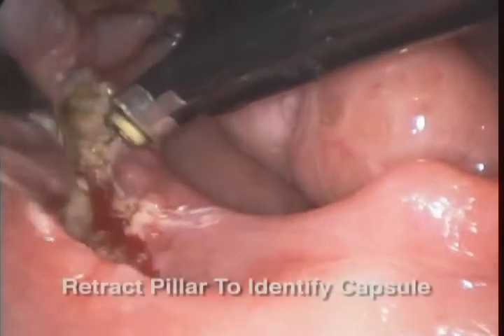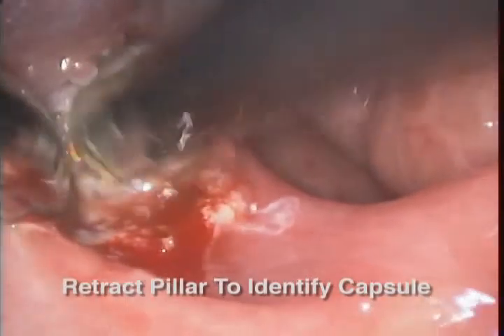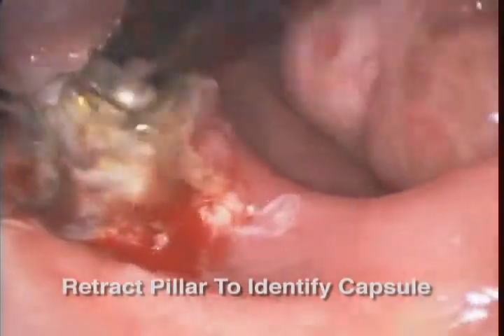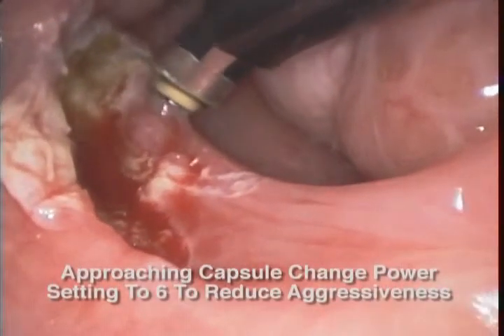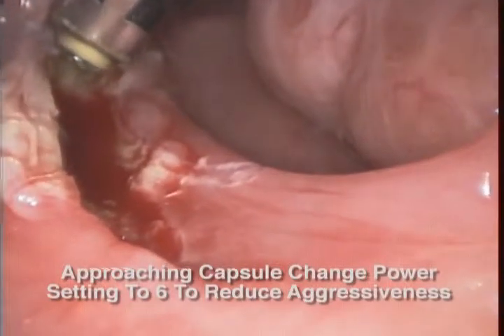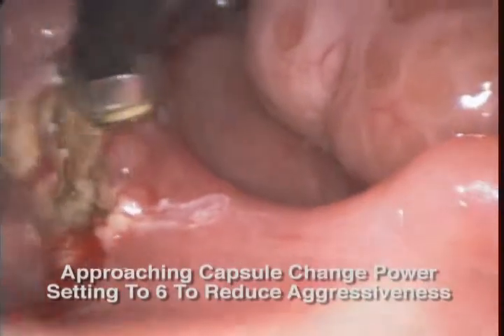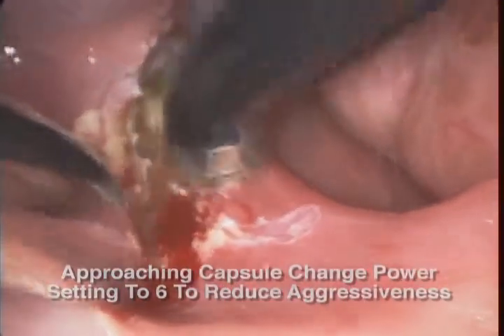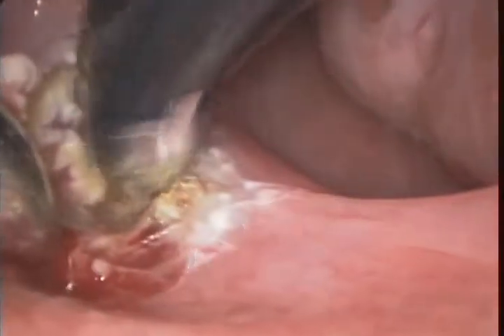I'm using the Heard retractor here to retract the pillar to try to identify as we're getting closer to the tonsil capsule. And as we're getting closer to the capsule, we will turn the ablate setting down from 9 to 6. Now, when you turn it down from 9 to 6, a few things occur. Number one, the ablation becomes a lot less aggressive, so it removes a thinner portion of tonsil tissue at a time.